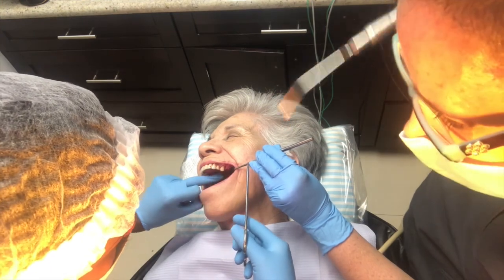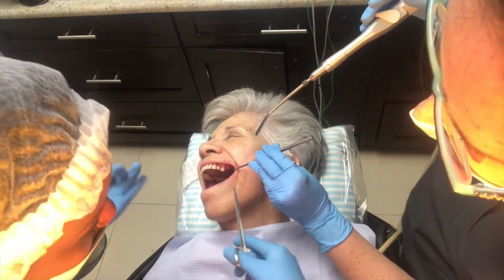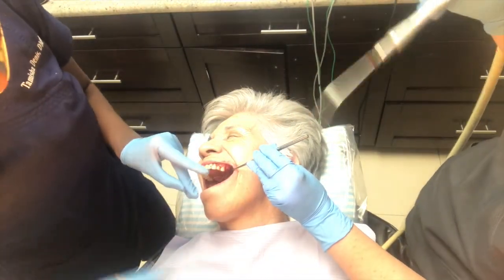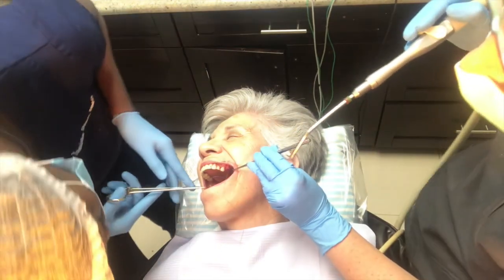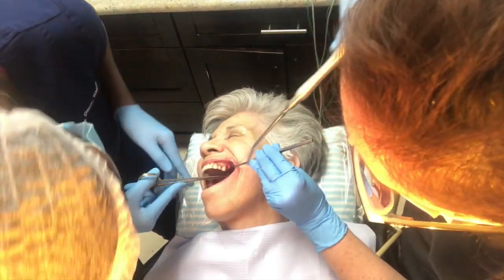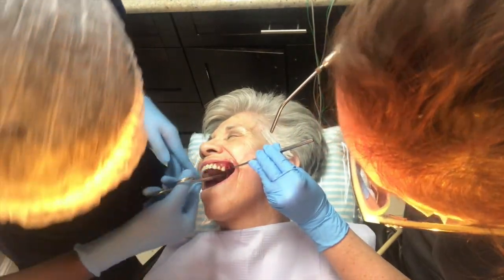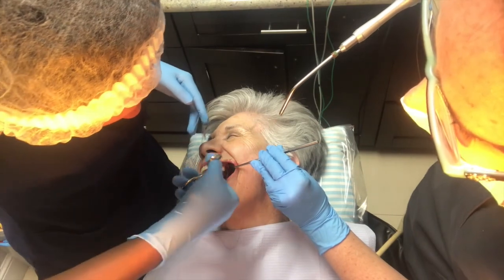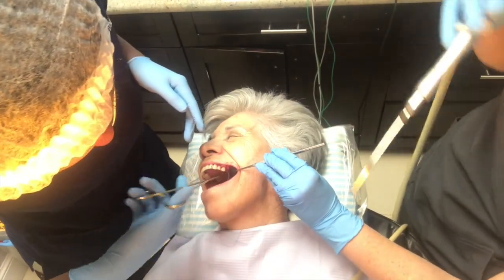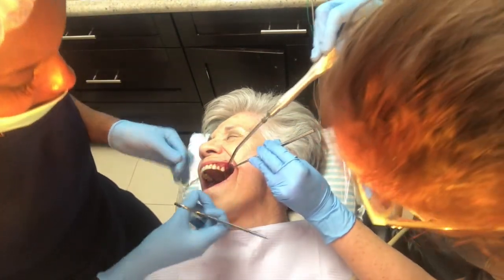I usually do a running suture with some knots in between to keep it as stable as possible. For the most part, most people don't feel a lot of pain after. Even the sutures are probably a little bit more annoying than anything because sometimes they'll start to hang. In 2 weeks, when I see her for her post-operative appointment, some people will have the sutures left and some people will not, depending on the person. It really doesn't matter as long as the area stays closed.